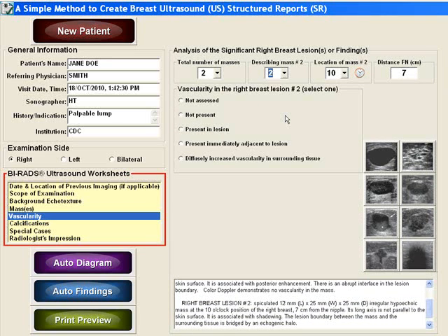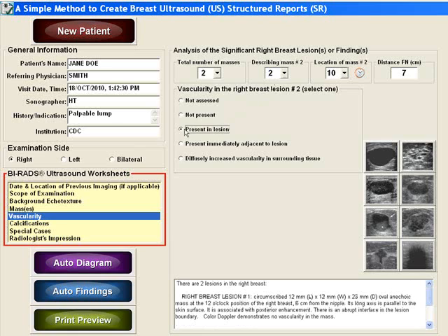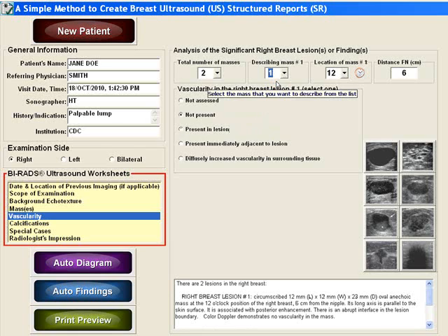For vascularity, select one of the descriptors. For mass number two, let's say that there was vascularity present in the mass. For mass number one, which we thought was a simple cyst, the default descriptor is not present.